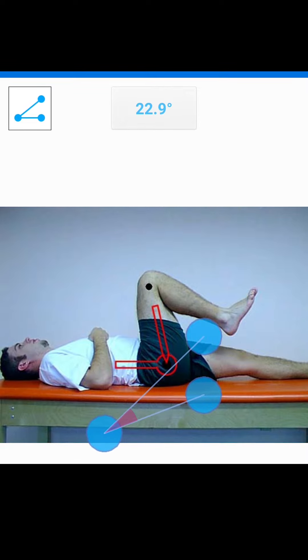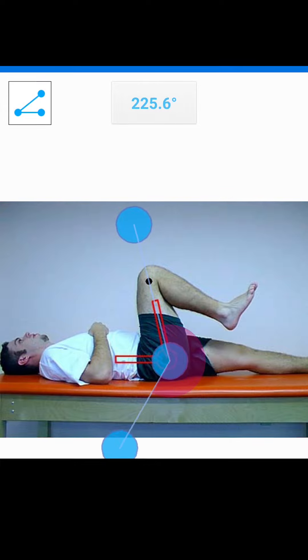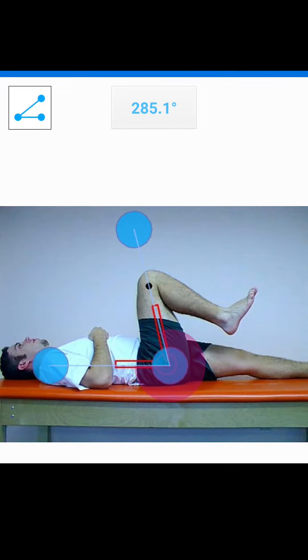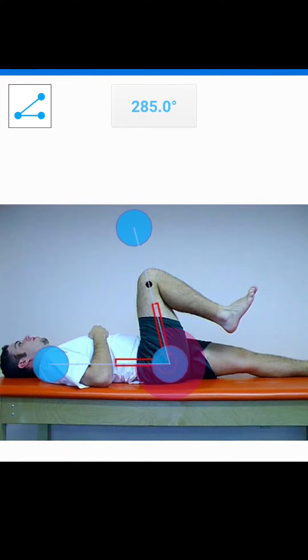So I've got this up, and if I align my protractor with the same angles, you'll see here I get about 285 degrees. He has not moved through 285 degrees of hip flexion, so I know that that's not right. This is probably just a little bit over 90 degrees here.